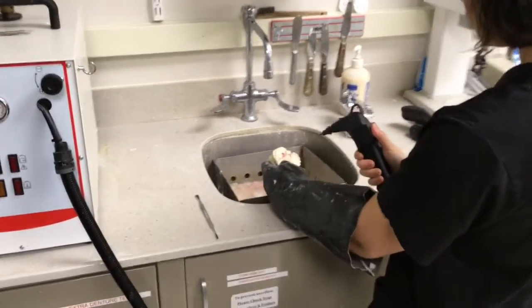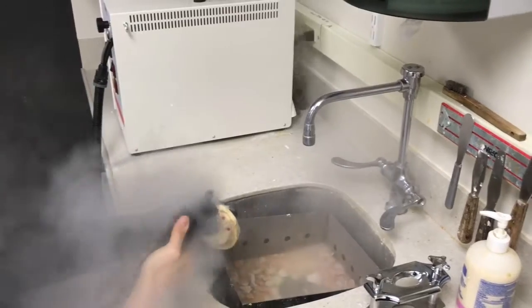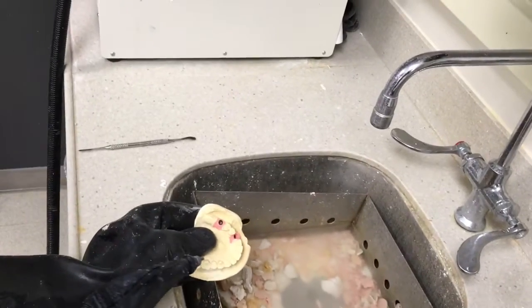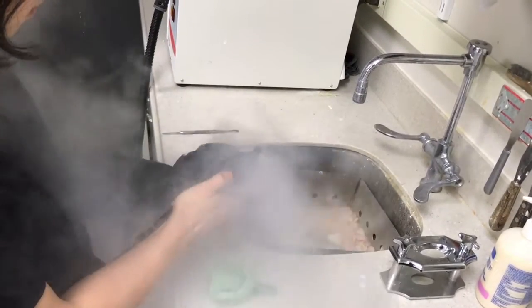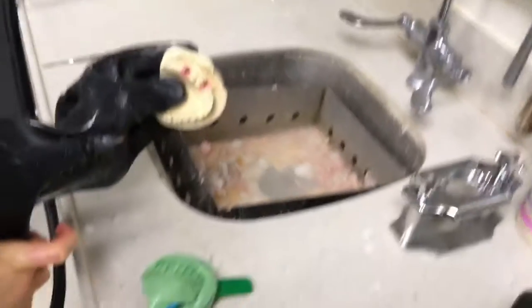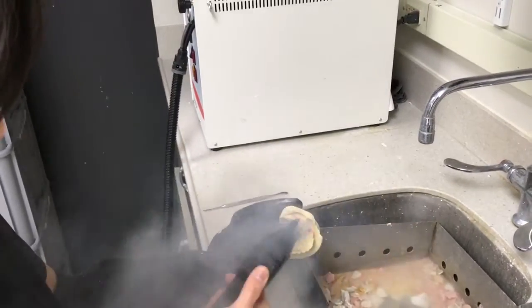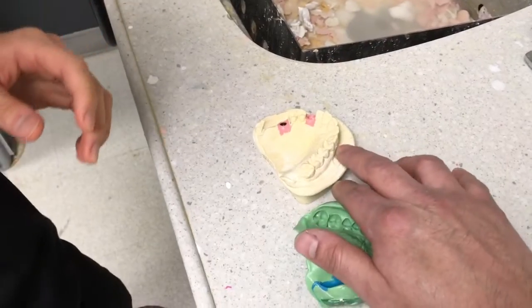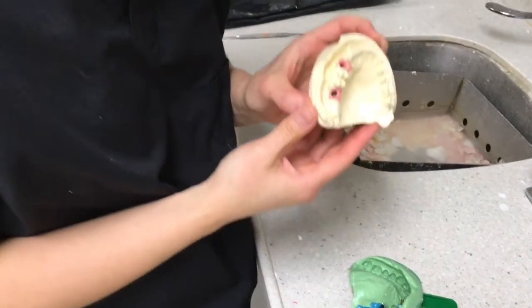Just steam it — it blows right off. Nice clean edges, nice sharp. Flake off that little part. There it is. Now you can just trim it so that you don't have any flash and trim it back — you're good to go. Awesome — there it is.